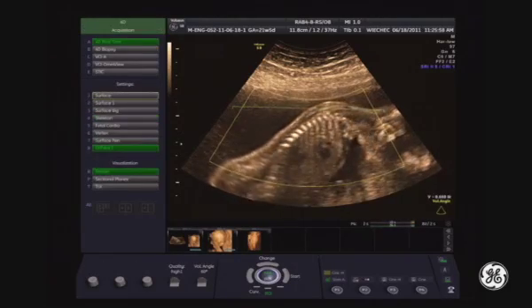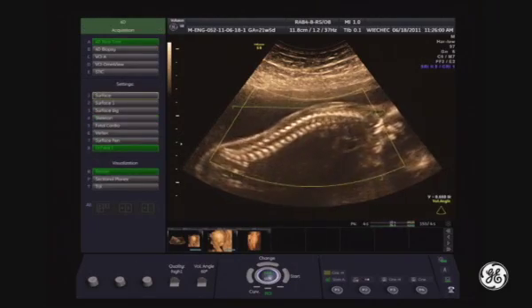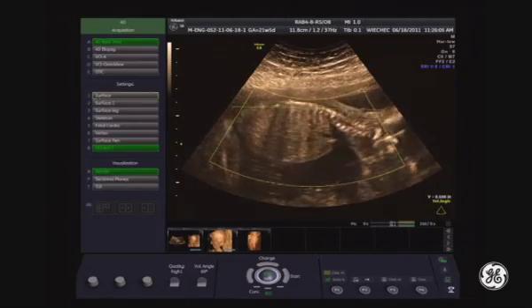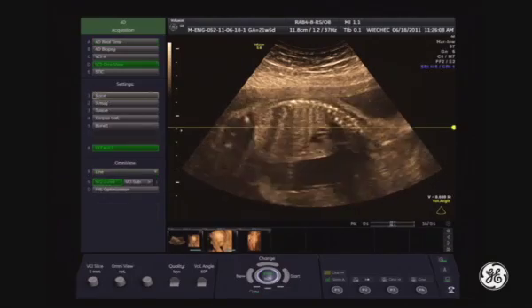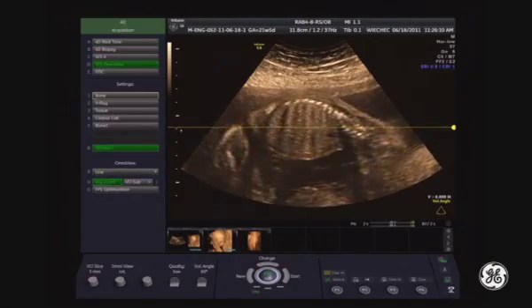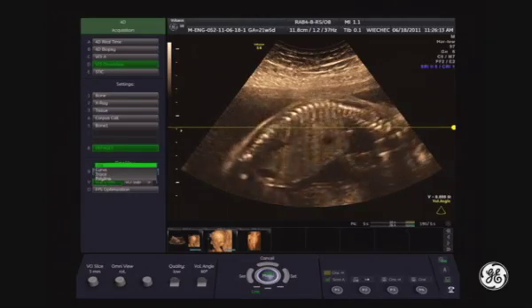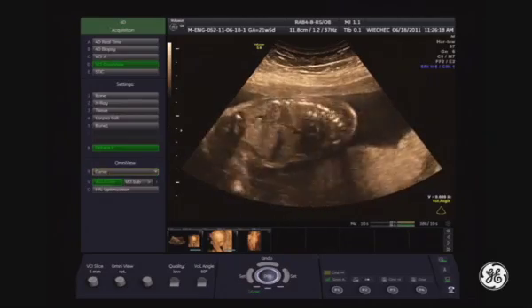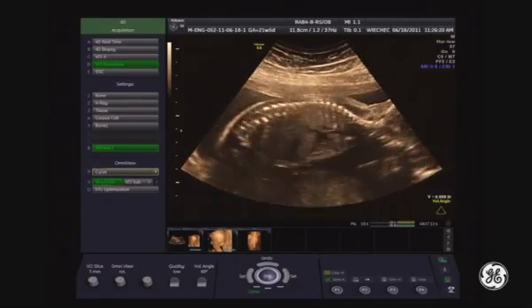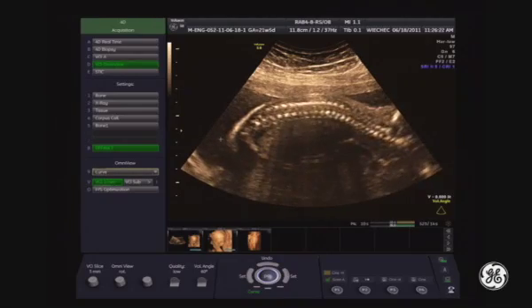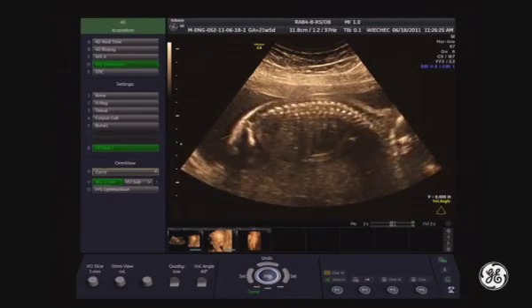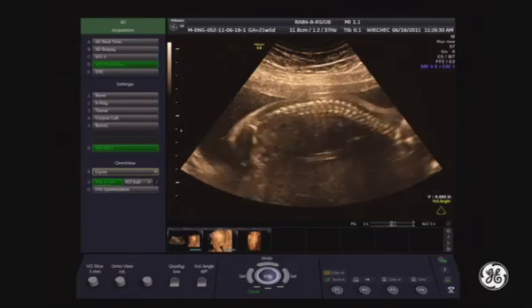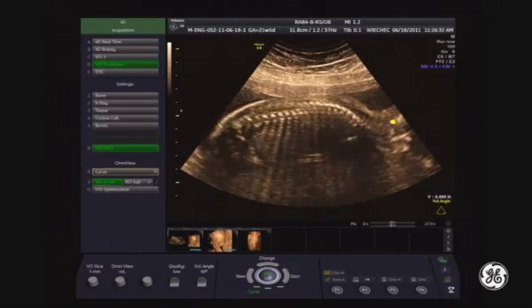Now let's make the dynamic one. I will select the viewing and acquisition option VCI OmniView. Here I will change the line into a curve line, and with the curve line I will place one of the edges at the end of the spine, the other at the beginning, and the third one in the middle.